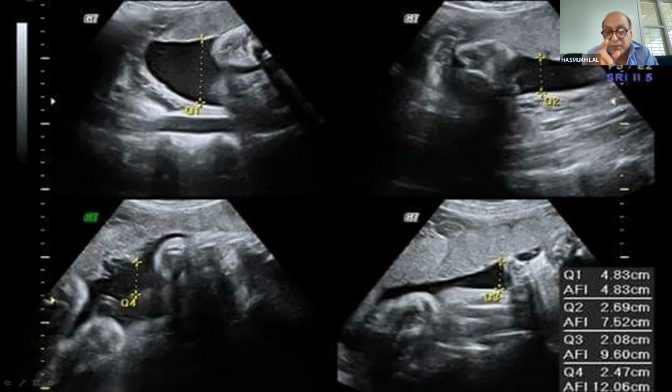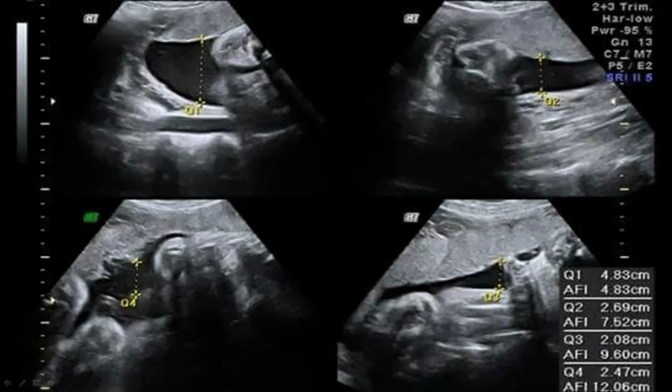And Ajit sir emphasized that in others we are going from below to up. For placenta, we are coming from fundus towards symphysis because we need to see the end of the placenta, where placenta ends, the attachment, the lower end of the placenta. So the right answer is B. And the improvement is from 47% to 70%. Correct. Good response.